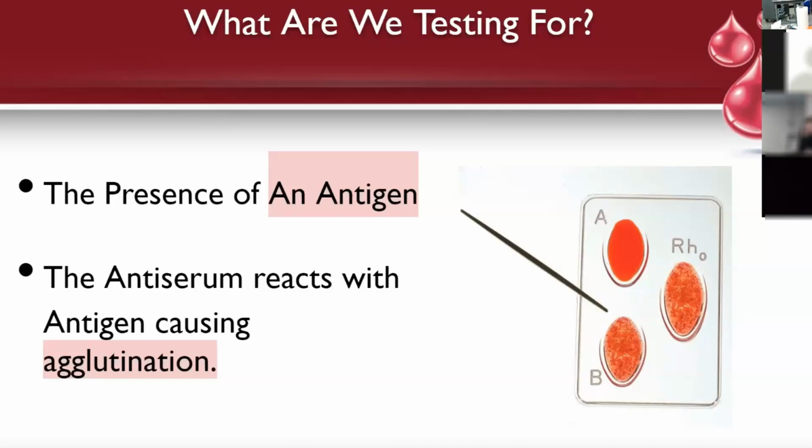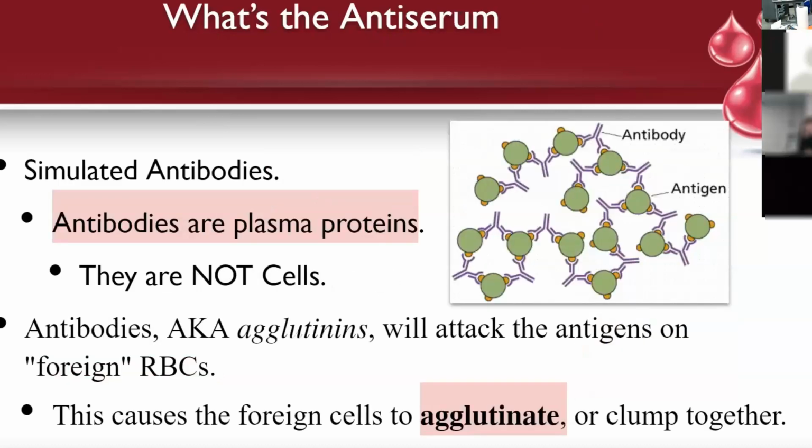Agglutination. So last week we did coagulation, this week agglutination. So the antibodies are plasma proteins. They're not cells. They attach to the cells. On the surface, they'll attach to that particular antigen. So the antibody for A fits A, like enzymes. Antibody for B fits B. And we know A and B are different shapes. So they'll see how they're going to cause them all to stick together and make a clump.